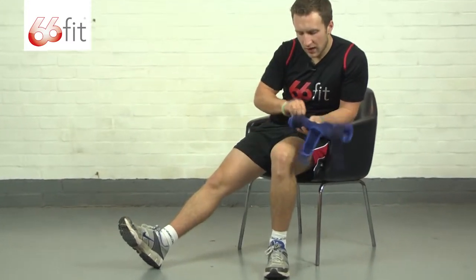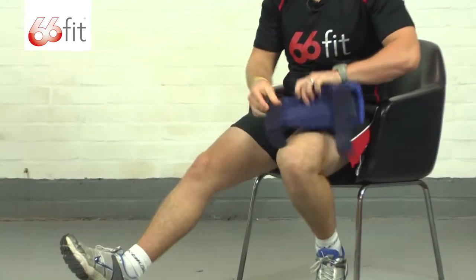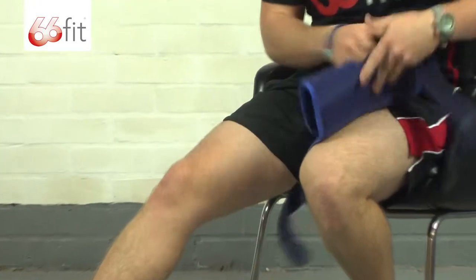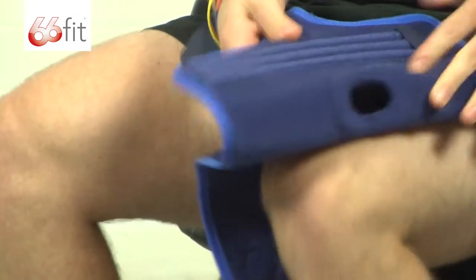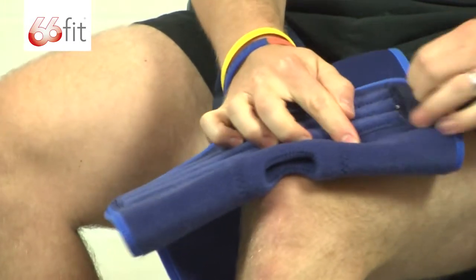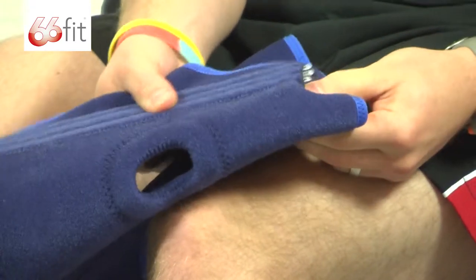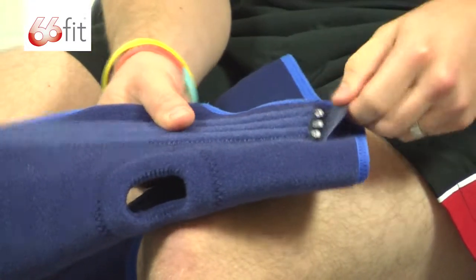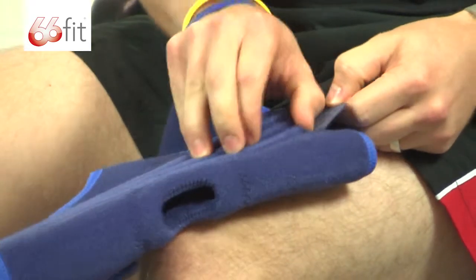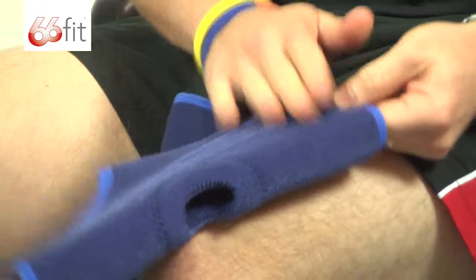A couple of things about the actual brace before I show you how to put it on. The supports that run down the length of the brace can be taken out — they just literally slide out. So if you do want to wash it, you can just slip those out, stick it in the washing machine, slide those back in and away you go.